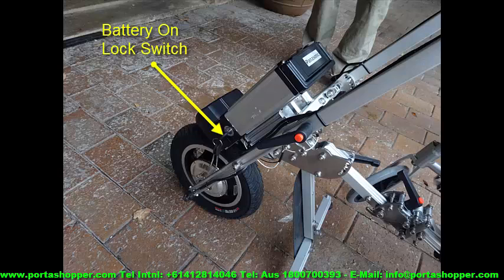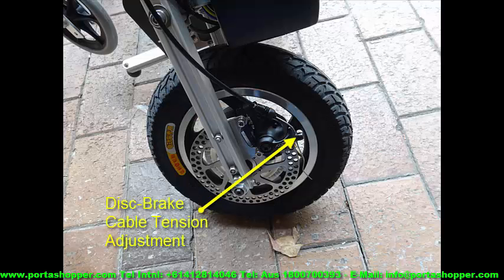This arrow points towards the battery lock, and remember your unit will not operate without this key being switched to the on position. To remove the battery, simply turn the key to unlock it, and you'll have to do this when you take it on an aeroplane. Lastly, even though your Portawheel comes with very powerful disc brakes, it's essential that you keep these adjusted at the right tension for the sake of safety.